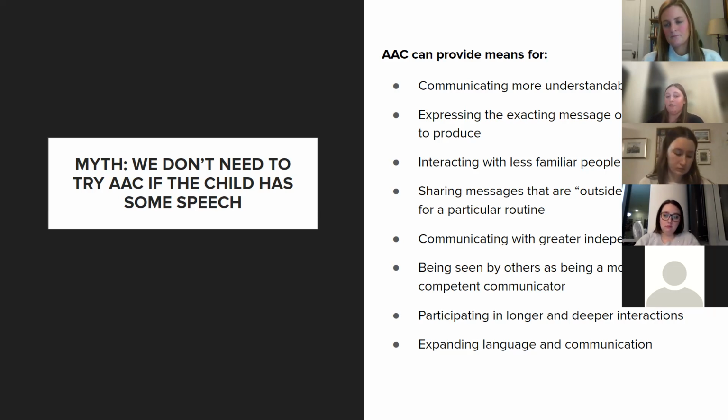So as parents and caregivers, you guys are the experts on your kiddos, but they are probably interacting with new therapists or friends, or as they go to school, new teachers, and being able to provide them that opportunity to interact with all communication partners. Sharing messages that are outside the norm of a particular routine, communicating with greater independence. We want to make sure that the goal is the kiddo to use their AAC device completely independently and have that autonomy over their communication. So that's a big one for that high-tech device.